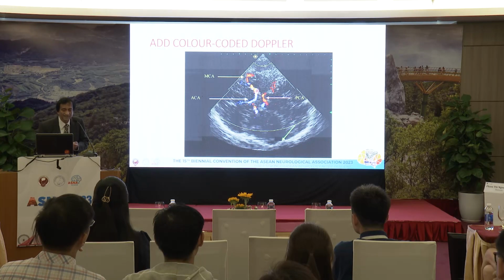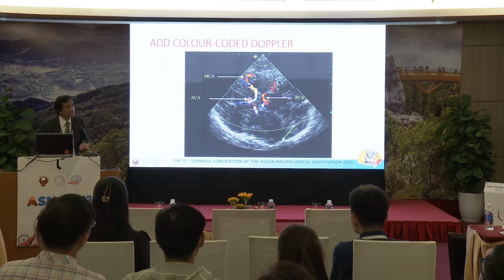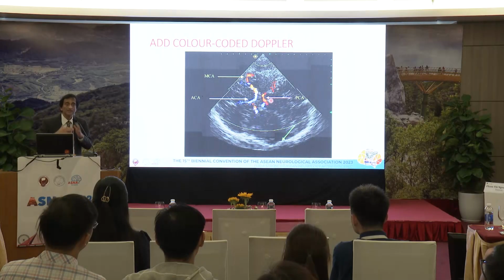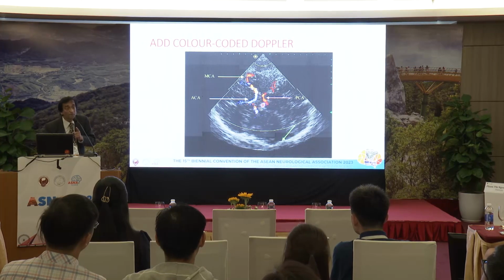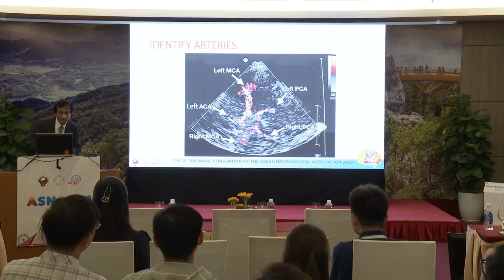What's in front is the MCA, beautifully coming towards you again. What's flowing away is the anterior cerebral artery. So in this single window, you can usually see everything if you put it right: PCA, MCA, ACA of that side, and the opposite side PCA, opposite side ACA, and maybe some opposite side MCA as well. All can be beautifully seen.